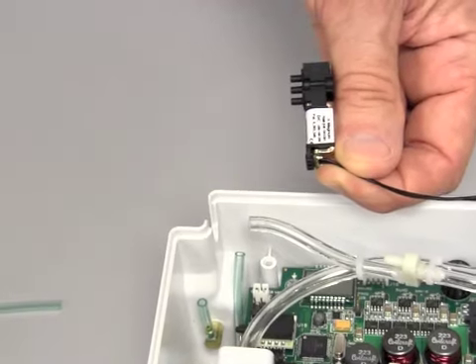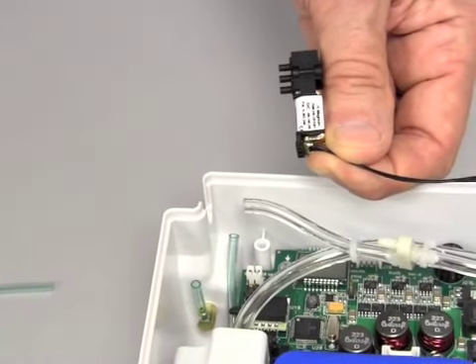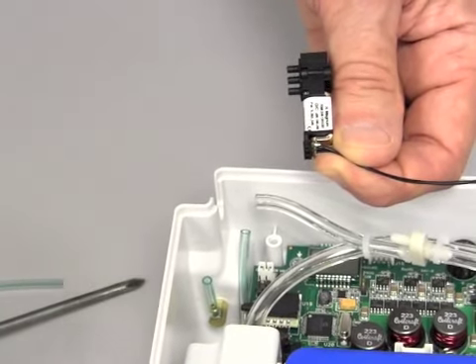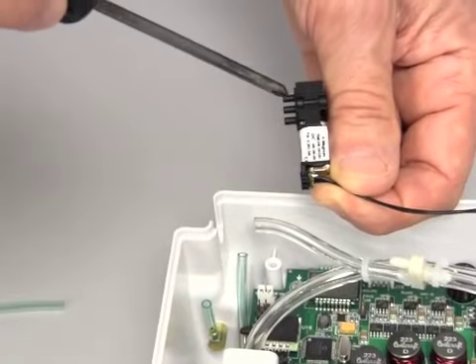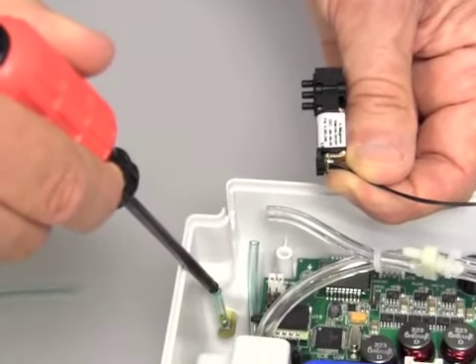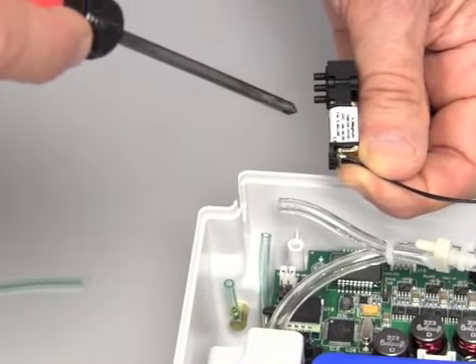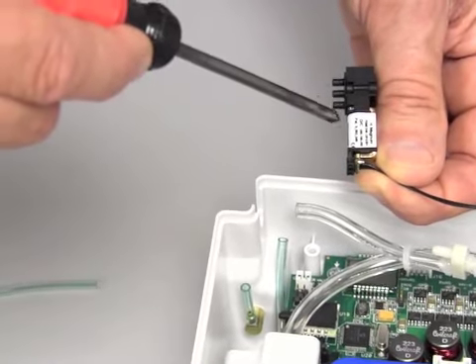Okay, now we're going to reinstall the Tygon back onto the valve. There's 3 pieces of Tygon that have to be reinstalled onto the valve. The first one comes off of the reservoir and is laying here. That goes onto the first barb. The Tygon that goes from the cannula goes onto the center barb, and the piece of Tygon that you cut off of this fitting goes onto the third barb.